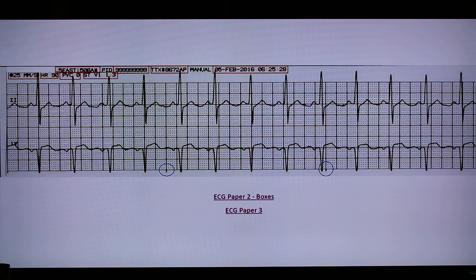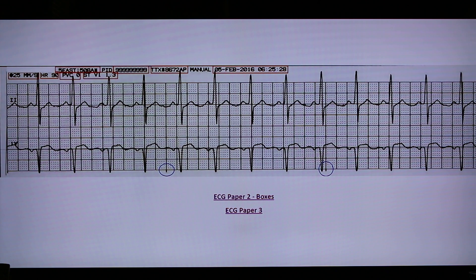The EKG paper will give you the usual small boxes and big boxes as a reference of measurement. The horizontal line is the time reference and the vertical line is the amplitude or size reference.